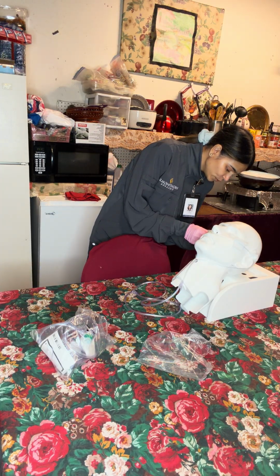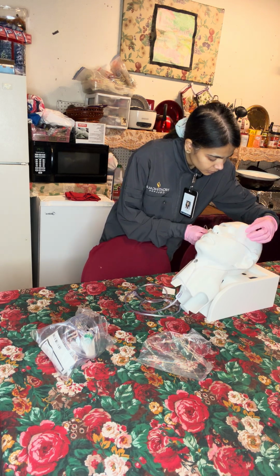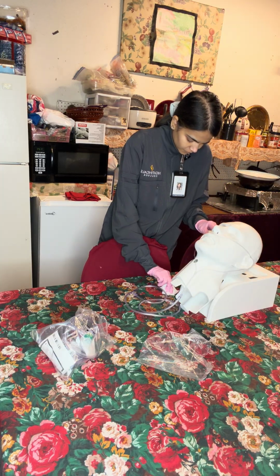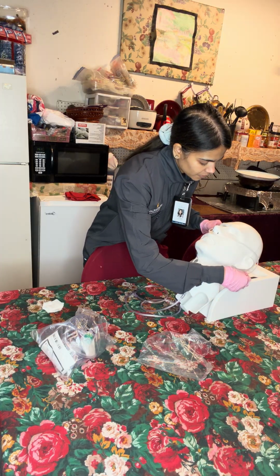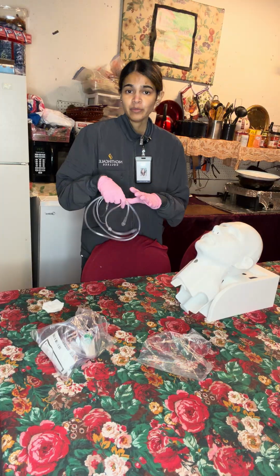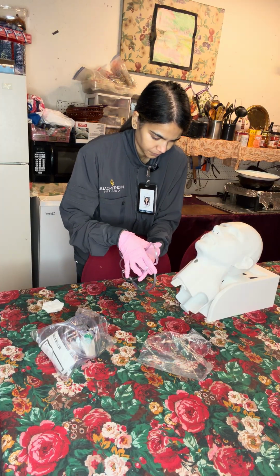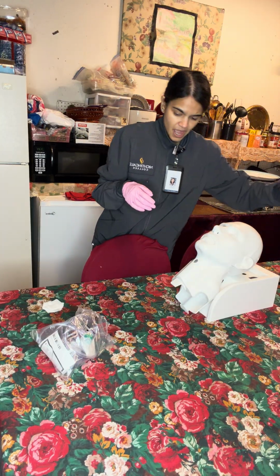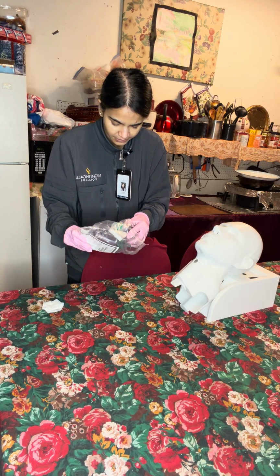I will begin to do so by taking out the gauze, and gently removing the nasal cannula from the patient. The nasal cannula will be disposed of in the appropriate bin. And we will begin by taking out the simple oxygen mask.